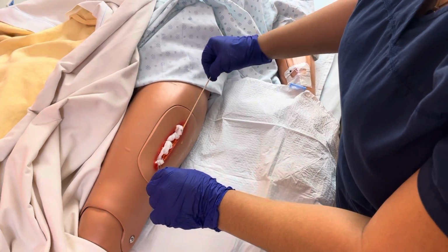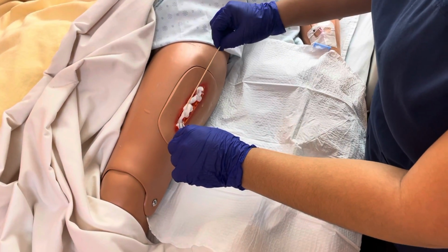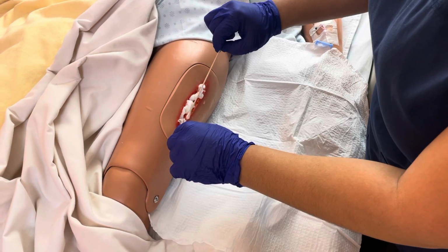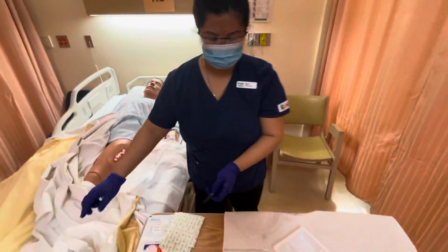So position this way. Okay, position this way when I take one. Position a little bit like this when I'm irrigating. Okay, that's good. And then we'll throw this into the garbage.